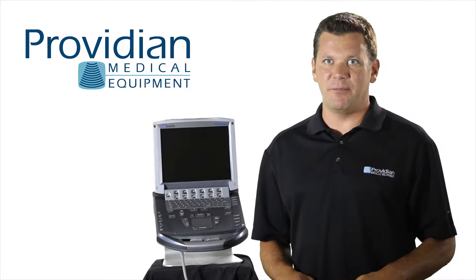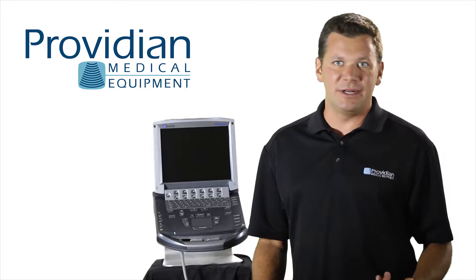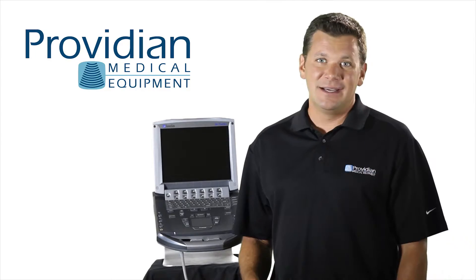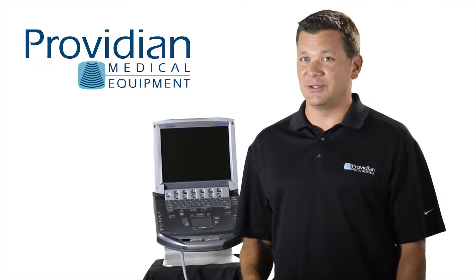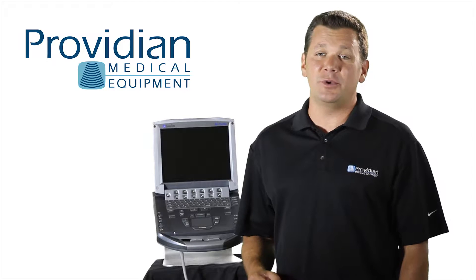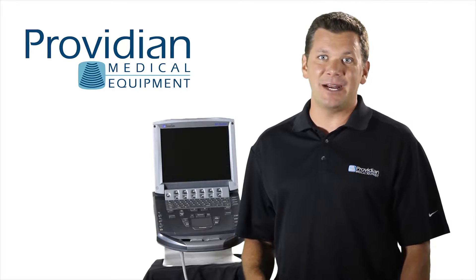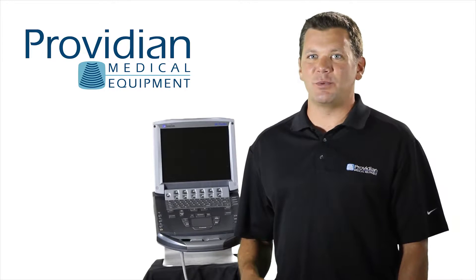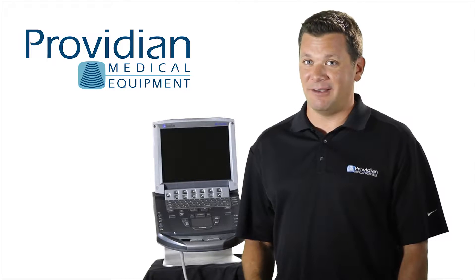This is a fantastic machine for point of care bedside ultrasound including needle placement, fast exams, emergency departments, anesthesiology, and more. It's an ideal system for physicians who are using this as a tool to visualize what's going on in the body, rather than something a sonographer would use eight hours a day making a lot of measurements, annotations, and calculations. This is one of the machines that was designed for a specific group of users.